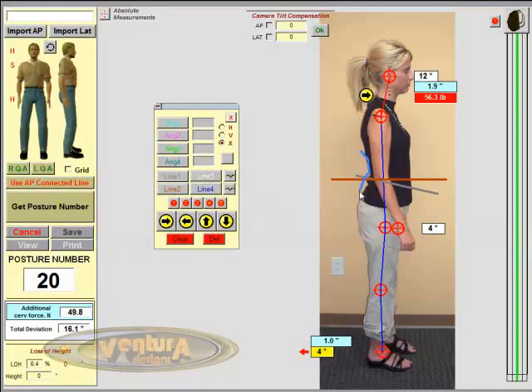So the athlete in this kind of a profile will be prone to more injuries and take longer to heal. So identifying this as a potential stressor or a speed bump to their overall progress is, to me, an important part of the overall process, and you can use Posture Pro then to also track progress along the way.